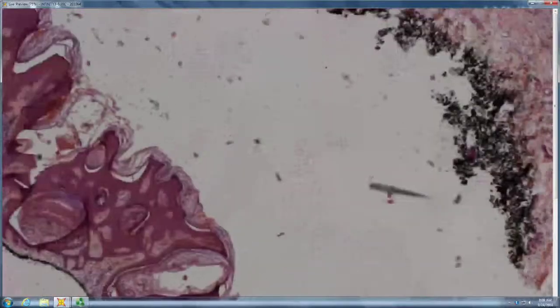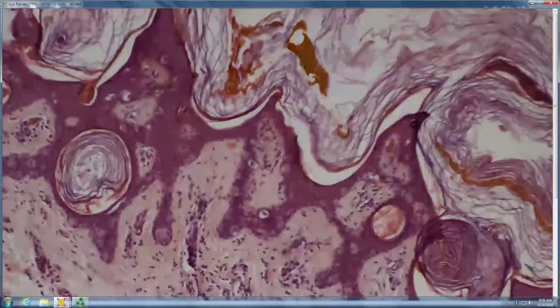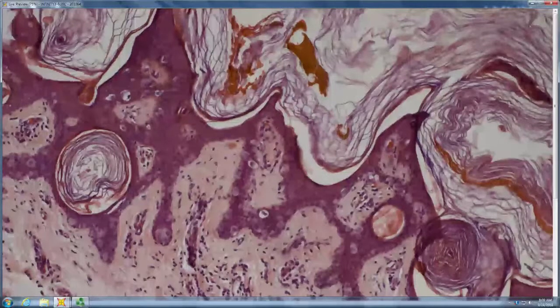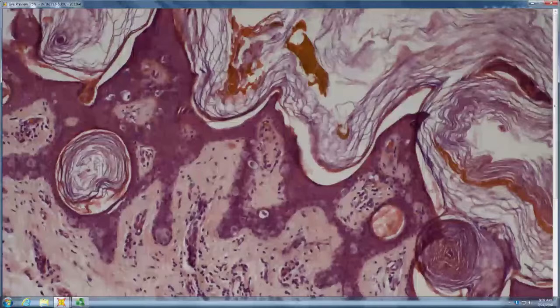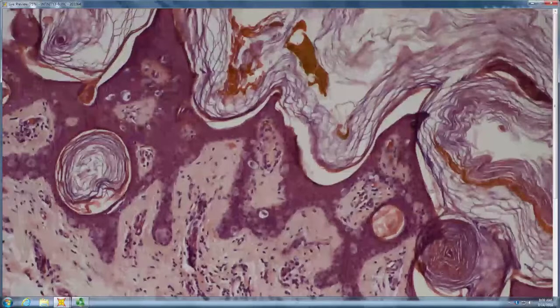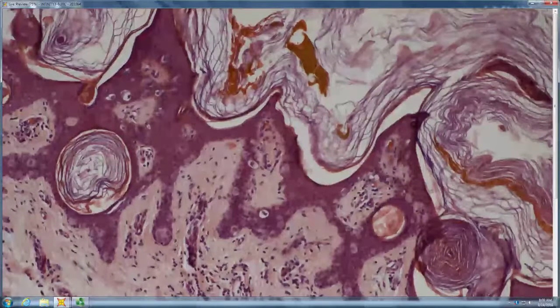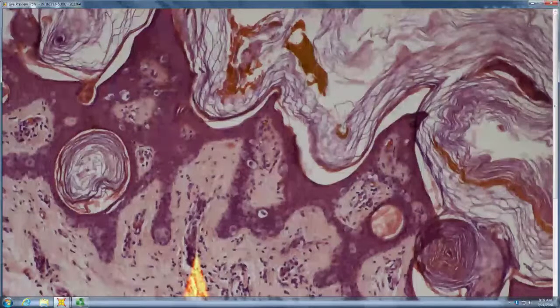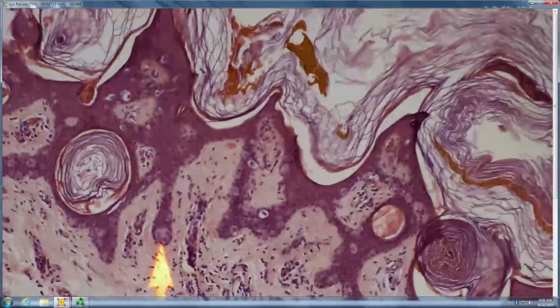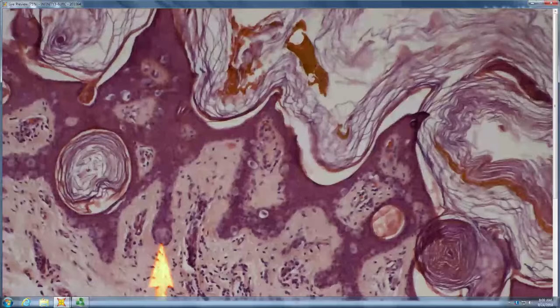It almost looks like a sub. Yeah, it looks like a seborrheic keratosis, and what's going on in the seborrheic keratosis? Lots of larger cells, or I guess it could be like Bowen's or Paget's. They certainly have that amphophilic pagetoid look. It's not clear whether they're at the basal layer or crushing a basal layer. At least this nest suggests some crushing of a basal layer. And this was, in fact, a seb on a woman's breast with the Paget's growing into the seb.